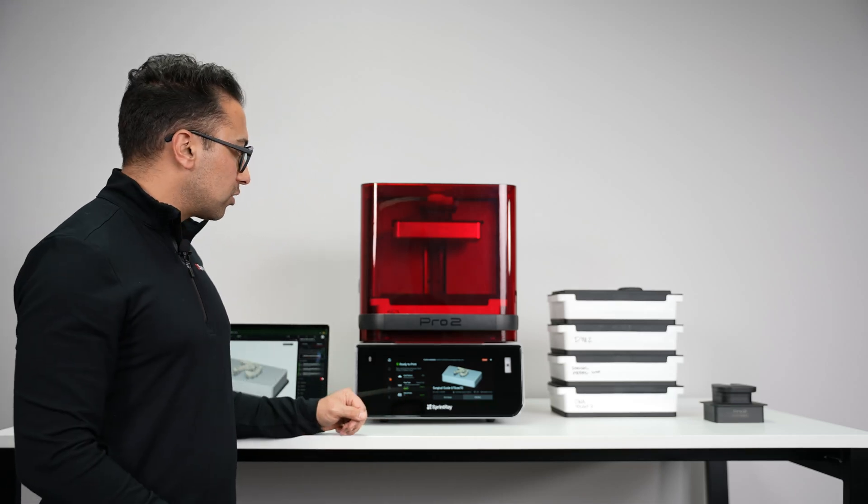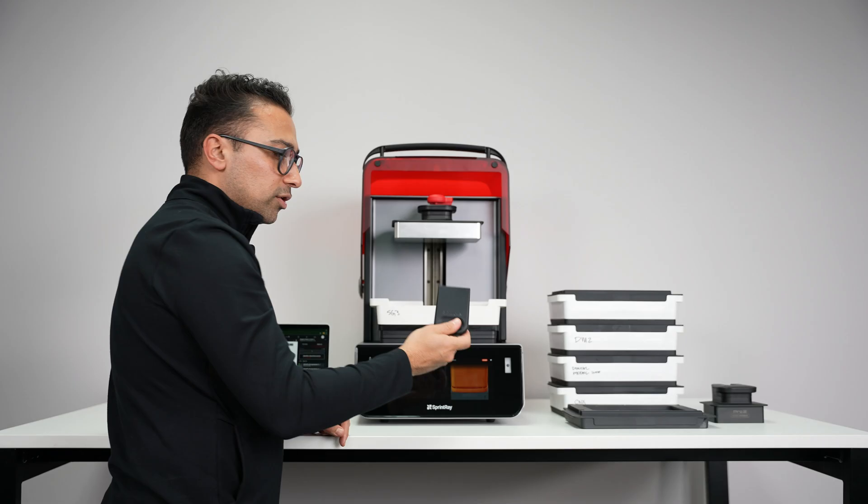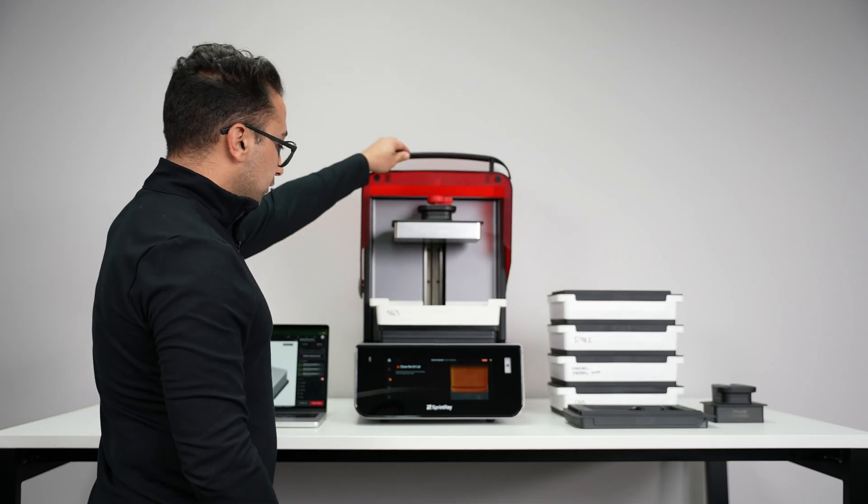Before we start a print, we need to make sure about a few things. Make sure that the cover of the resin tank is removed. Use the rubber squeegee and mix resin very well. Close the UV lid.